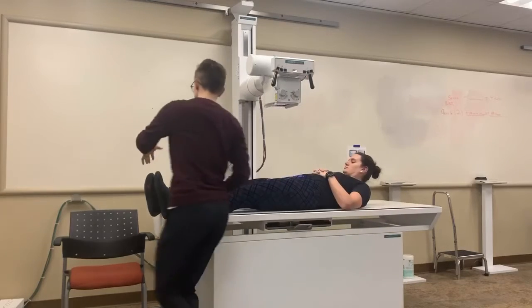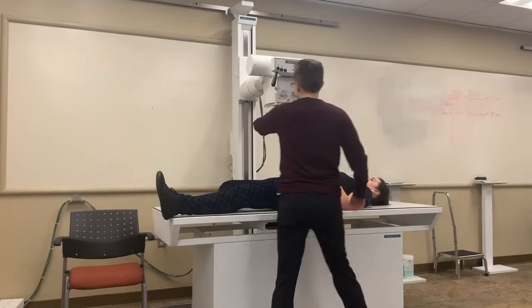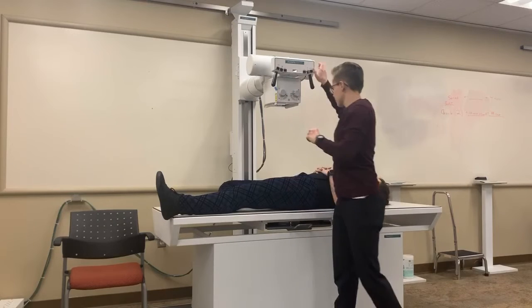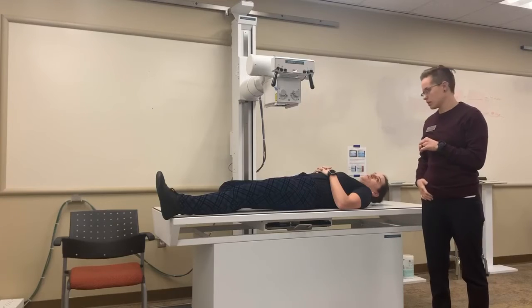For patient positioning, we're gonna bend the knee and take that foot and put it right against that knee. You're still at 40 inches image grid, no tube tilt. And this one we collimate just under film size. Don't breathe, don't move, no filter, no shield. That's frog leg hip. Always on the affected side.